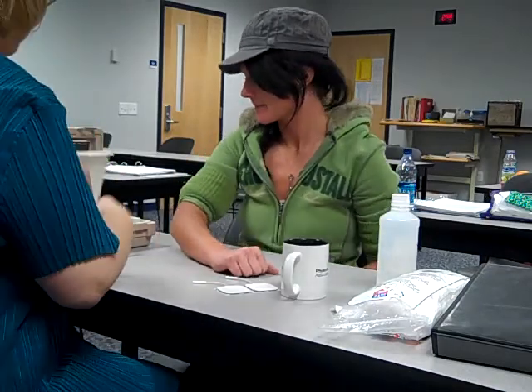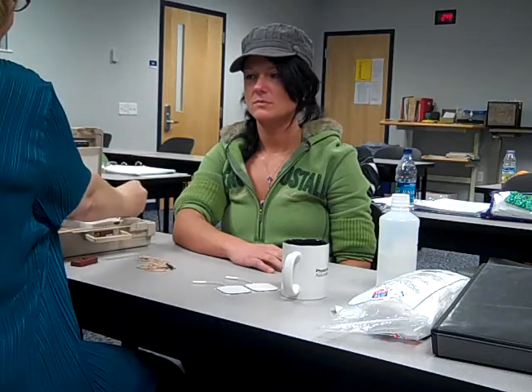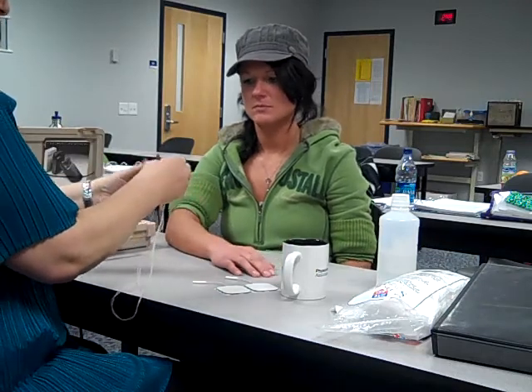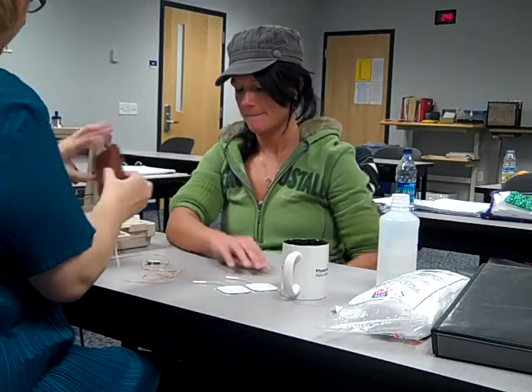I'm BJ from physical therapy. I'm assuming that everybody watching this has also watched the high rate TENS video, so you saw the whole thing about how to put the unit on and have the patient do it. With this video I'm going to talk about low rate TENS and the difference between the two. I'm not going to go through the whole item I did on the first part of the check off.